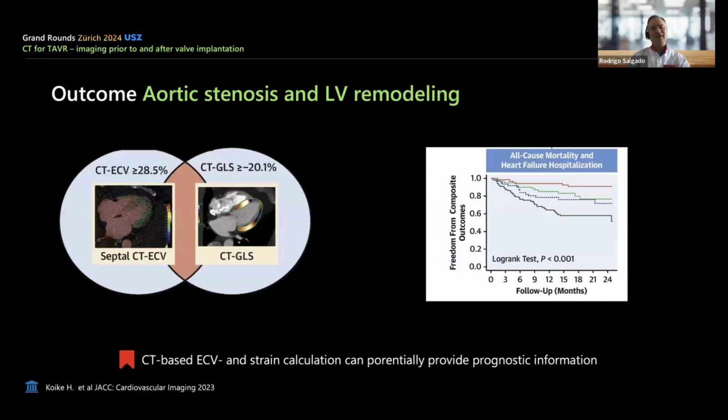And this is, I think, a very exciting field with CT, as we are expanding our application by looking at extracellular volume with CT, so that we can detect myocardial abnormalities, also, for example, by doing strain imaging. So when we have a patient, we can not only deliver the morphology of the aortic sinus, but also have an assessment of the damage that the myocardium already has, which might influence, as this paper insinuates, prognostic information beyond the plain restoring of valvular function.